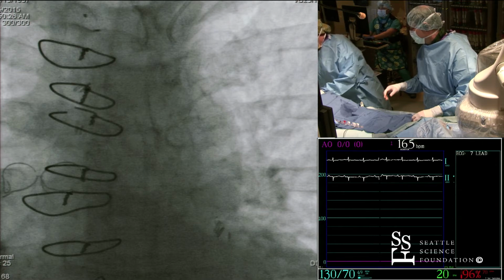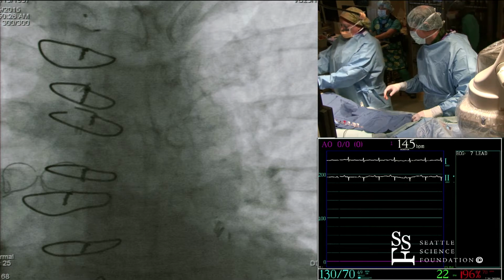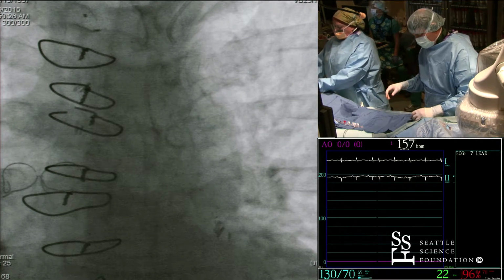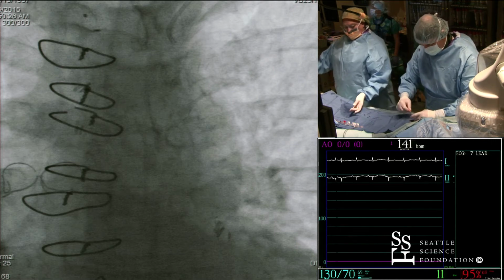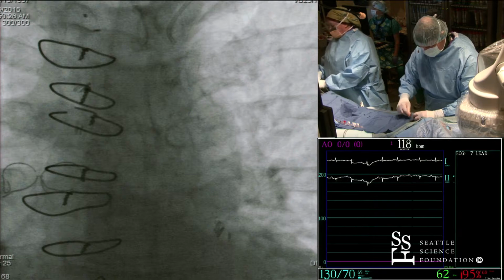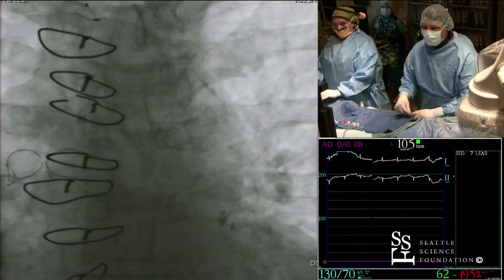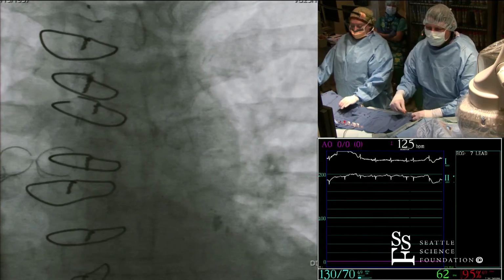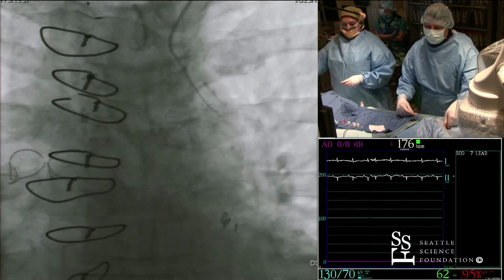No, and that's been looked at pretty well. So we got a lot of data from both RIVAL and MATRIX about stroke risk, and it's no more. I mean, yeah, you could do stupid things, right? But as long as you're careful. If you have a wire that's gone up the carotids that you're not aware of, or up the vertebral, the left vertebral, that would not be good. So the danger of doing it by feel and not by fluoro is you could go north and not be aware of it.